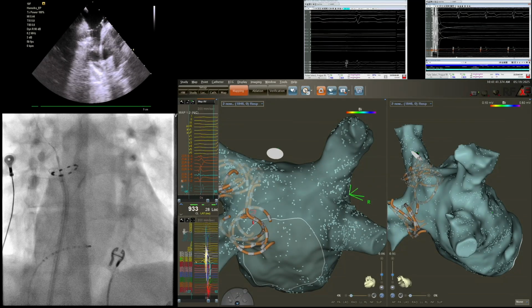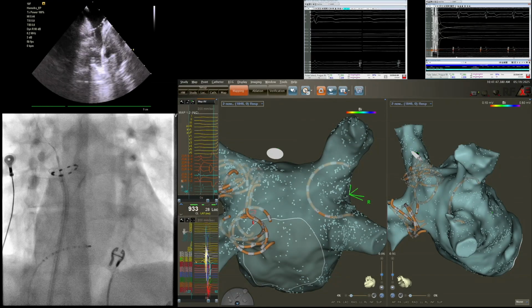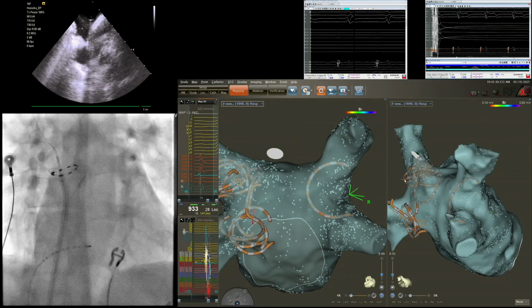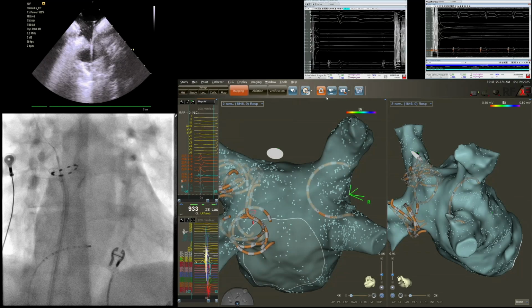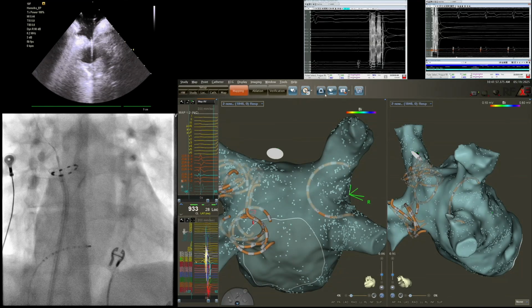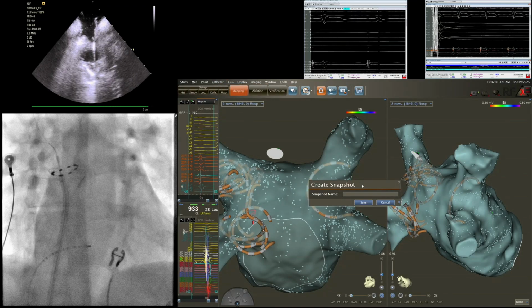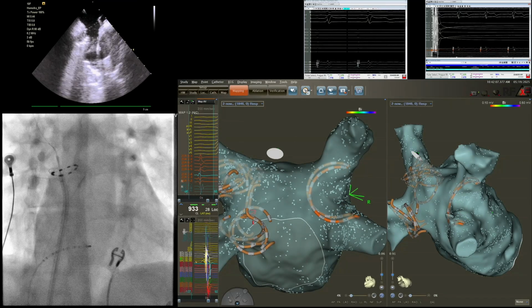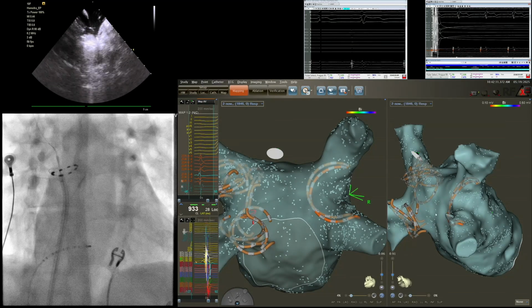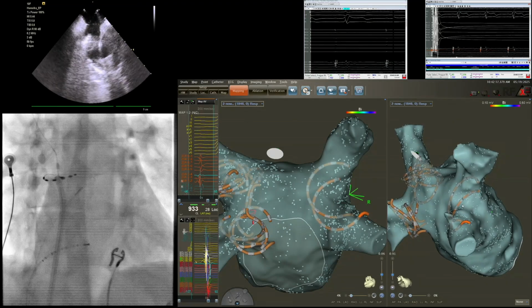As I mentioned, upper veins are, for me, more alarming for getting the gaps. So I really want to get better lesions. But actually, it is always good to minimize. All these technologies, I think, are about how to be efficient but with minimal applications, to get optimal dosing and optimal application.